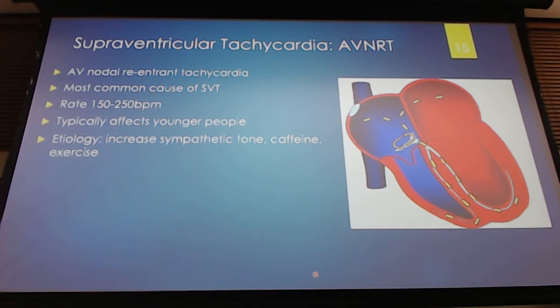So that's it for sinus tachycardia. PQRST, look at your lead 2, look at your aVR, upright P in 2, downgoing aVR, and you're going to have your PQRST. Fever, thyroid problems, stuff like that will cause it.